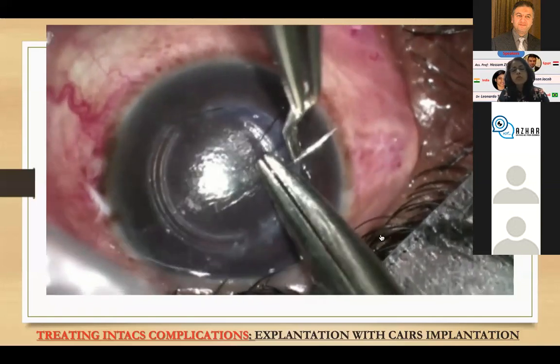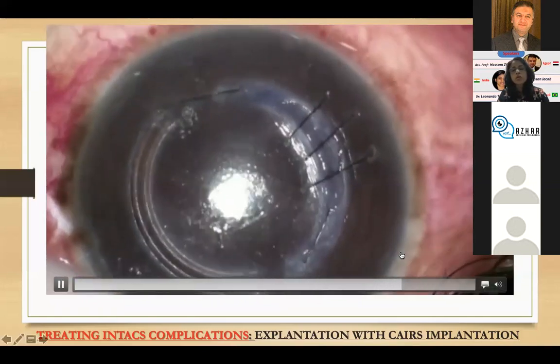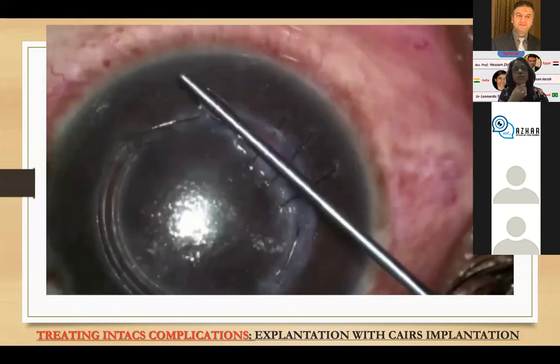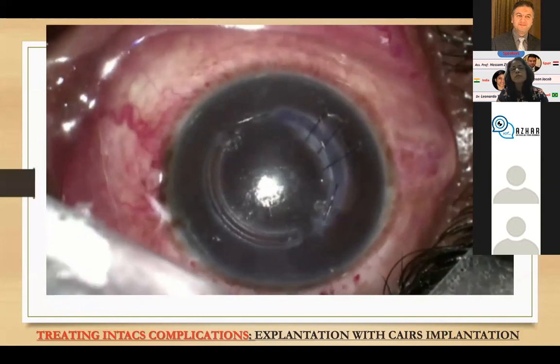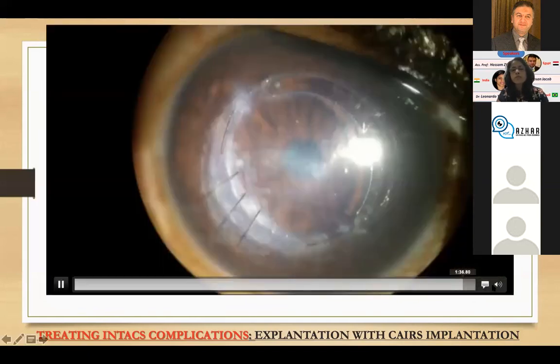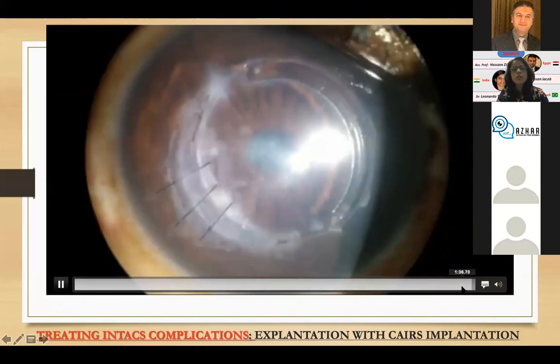Now, after I put those three bridging sutures, I also put glue on the sides because I had access to it, but obviously it would not be necessary in all cases if you don't have access to it. And then I put a bandaged contact lens on the patient's eye. So this is the immediate post-operative period, and you can see how the patient looks.